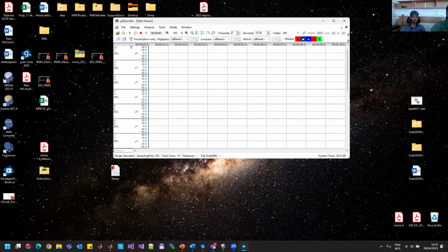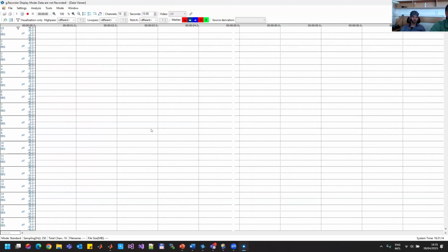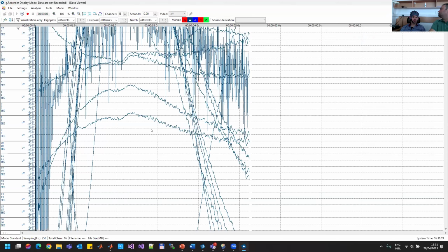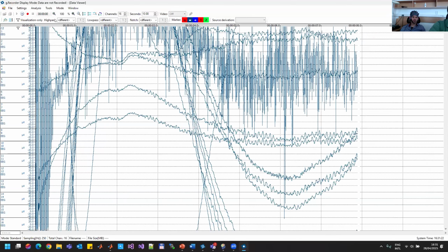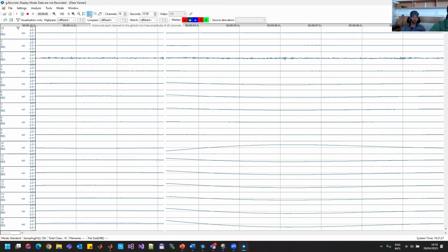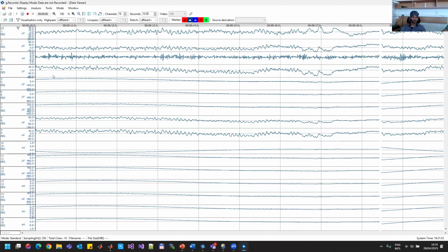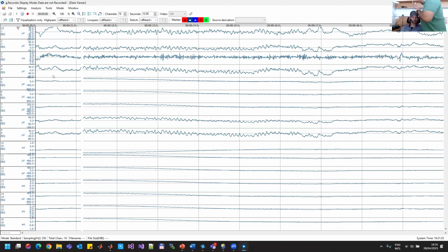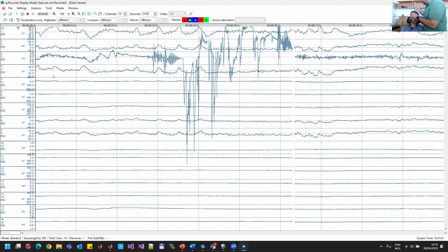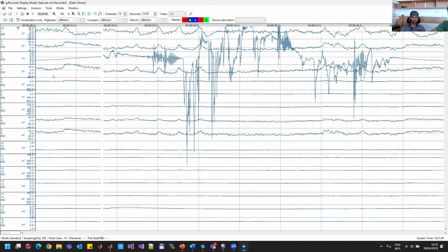Okay, channel 16. All channels, and have a first look at the EEG signal. And I will auto scale all these channels. Okay, on the third channel, probably I have to add some gel. So which is 1, 2, 3, this one here. Okay, now it's a bit better.